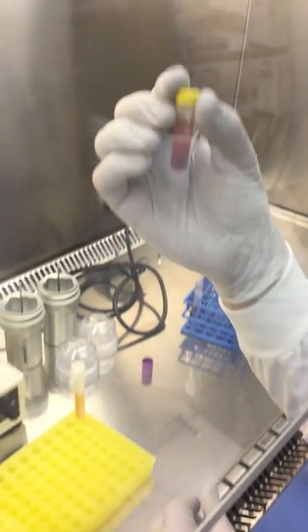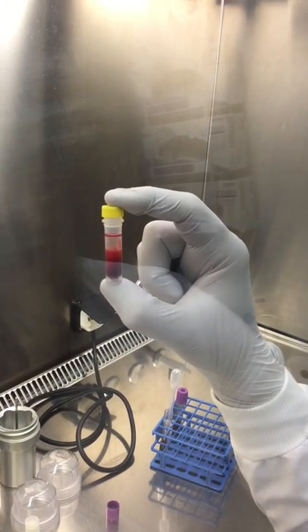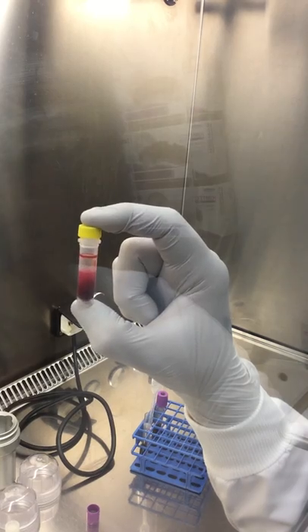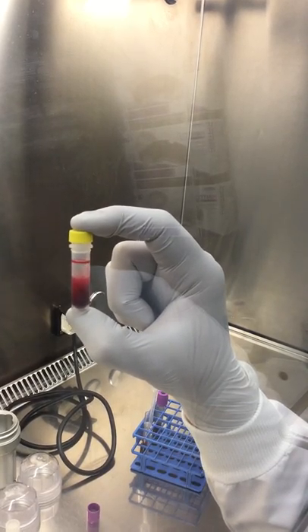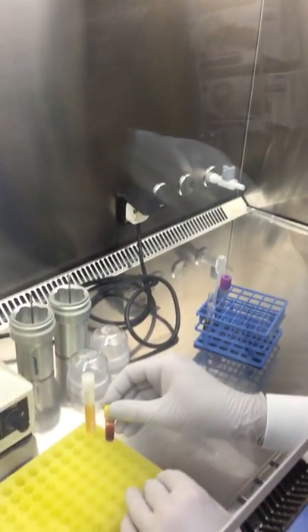As you can see, I've taken up a reasonable amount of red cells. However, there's mostly Buffy Coat in there, a little bit of plasma too. And that's how it's done.